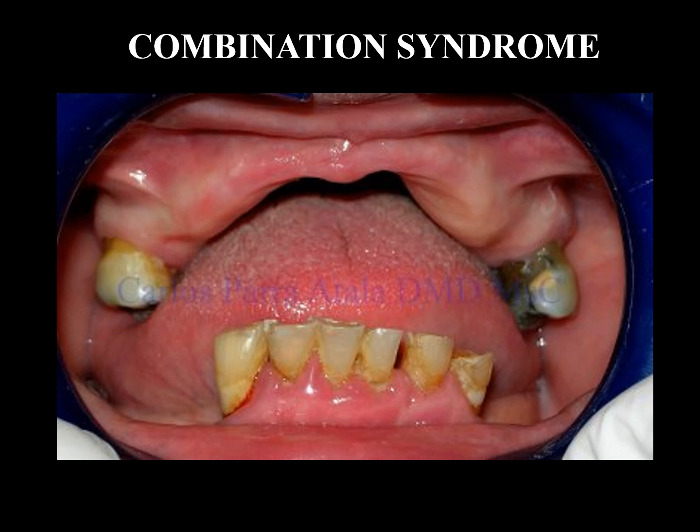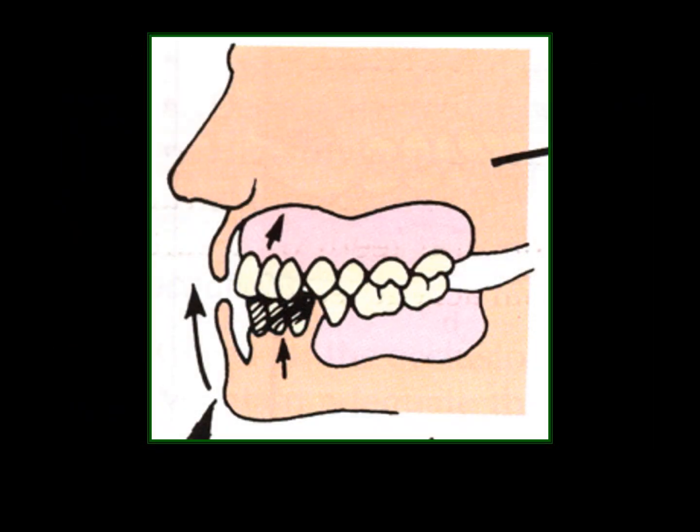So this is a problem which occurs when we replace maxillary teeth opposing a mandibular removable partial denture, which means there is an upper complete denture, where we are going to replace the full upper set of dentition, and in the lower we have only the mandibular anteriors remaining, and the mandibular posteriors are missing. So what is the challenge faced in this situation?